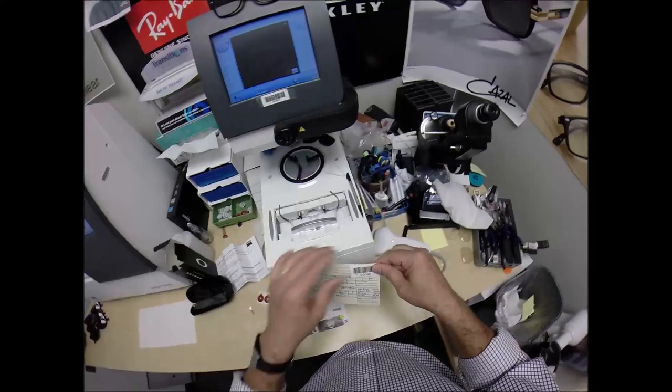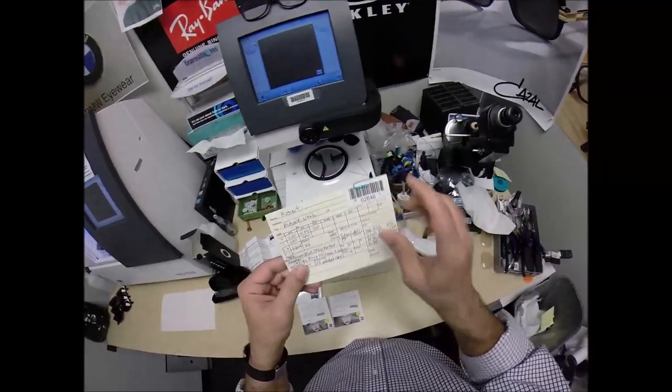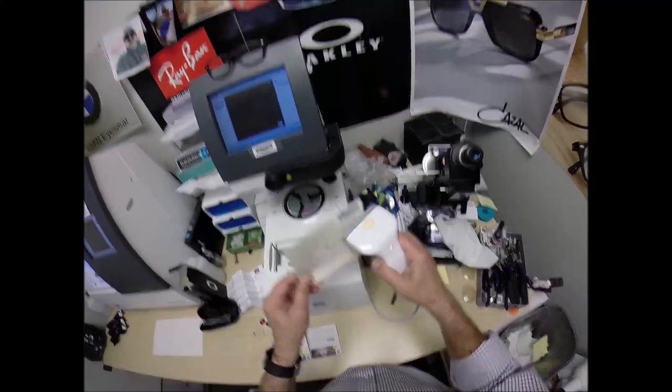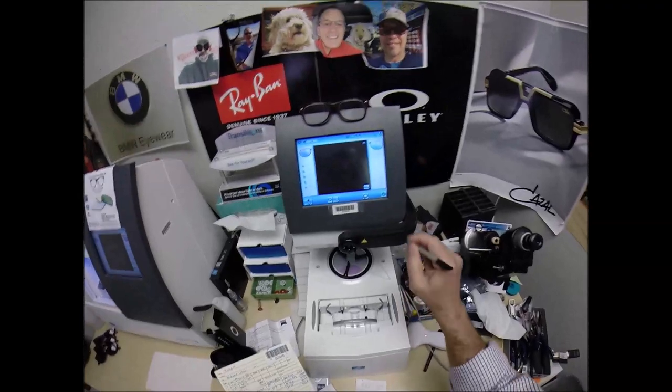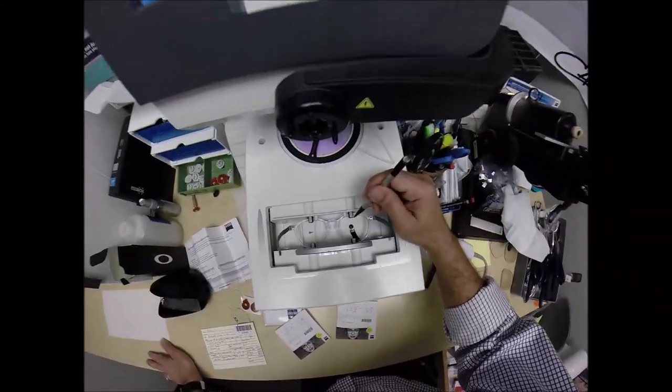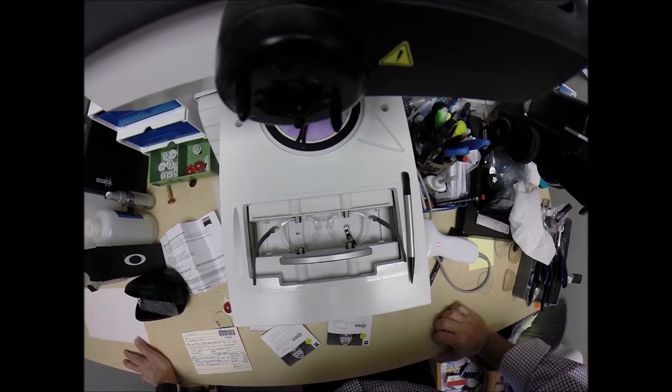So years from now, should you ever need new lenses, I can program, pop this up. I'm about to program it into the computer, but I can pull up this shape and cut new lenses right to your home, and you're going to see how to install them just like I do. I'm going to hit the start button. A little stylus is going to pop up. Go around, trace the inside bevel of the right side of the frame before doing the same thing on the left.